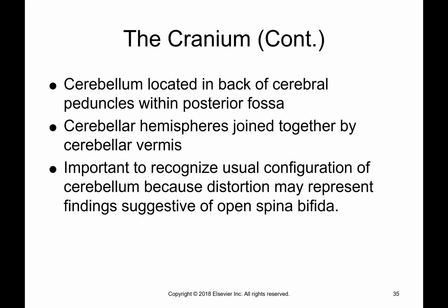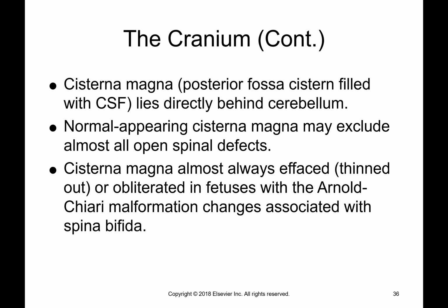The cerebellum is located in the back of the cerebral peduncles within the posterior fossa, and the cerebellar hemispheres are joined together by the cerebellar vermis. The cisterna magna lies directly behind the cerebellum. A normal appearing cisterna magna may exclude almost all open spinal defects.